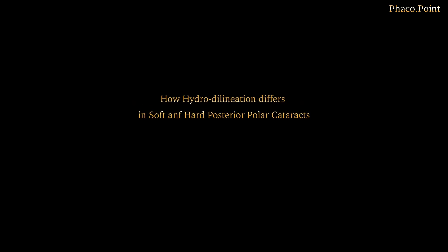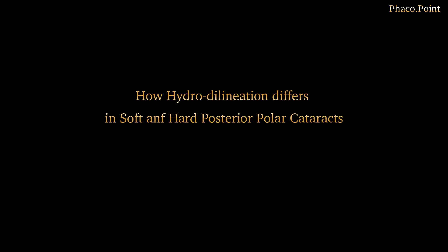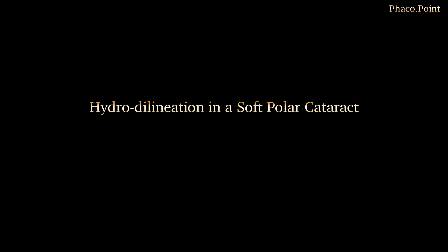In this following video, I'd like to demonstrate the differences noted whilst performing hydrodelineation in a soft as well as in a hard posterior polar cataract. Let's start with watching the hydrodelineation procedure in a patient with a soft polar cataract.